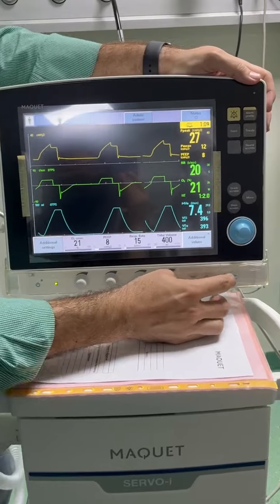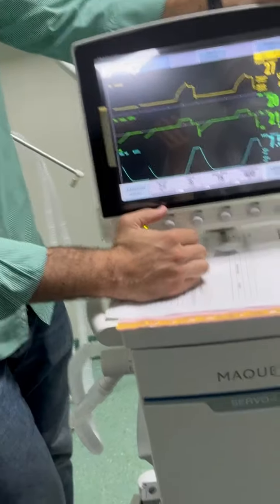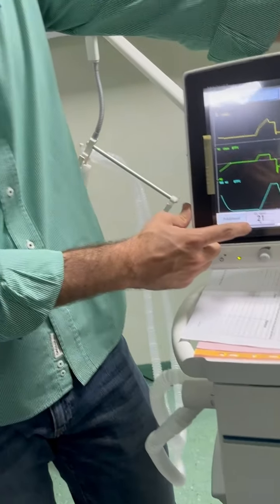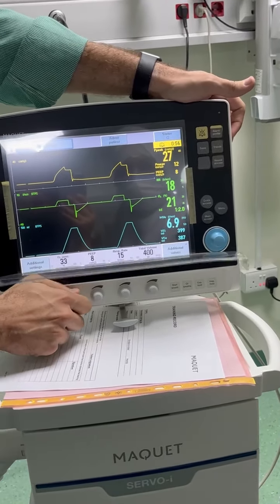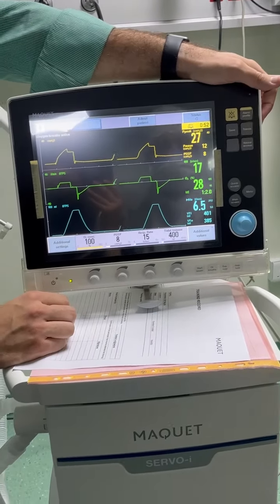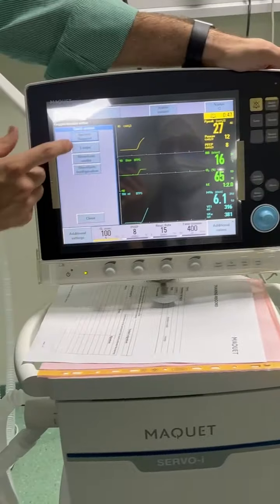What do we have here? Inspiratory hold and expiratory hold for static measurements. What's the oxygen breathing? Oxygen breathing, it will auto increase the oxygen to 100%. O2 suction. So you have two ways. Either you can increase from here, or you can just click on auto breath. One click only. What is this quick access? Click on it. Quick access will give you suction.